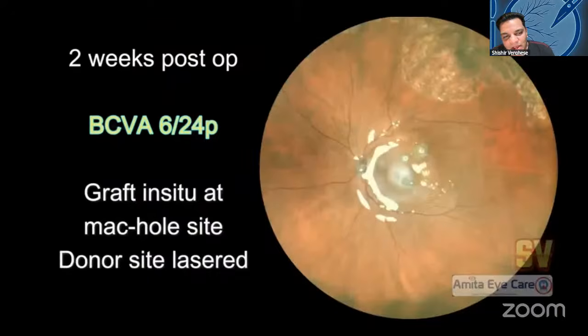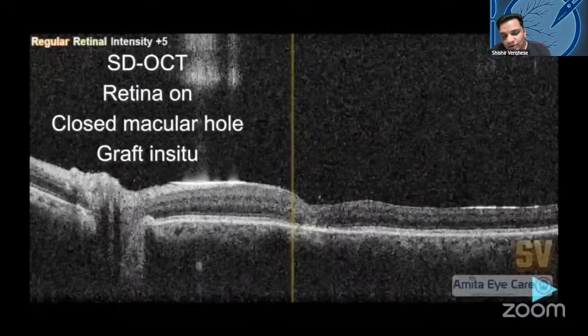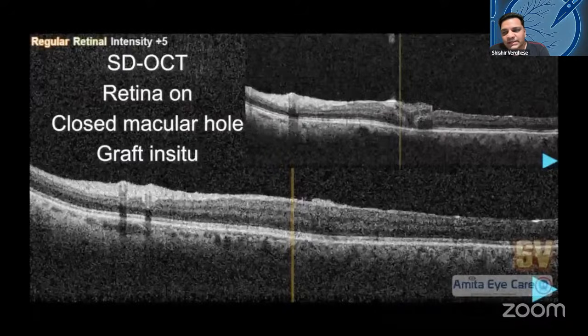And I don't know how, but this patient improved to 6/24 vision. Her pre-op was counting fingers at 3 meters, and post silicone oil removal she was maintaining 6/24 vision. And this is the post-op OCT under oil. And there's also one OCT which is after the silicone oil removal. I think Dr. Bhavik has that. Yeah, so she improved to 6/24.